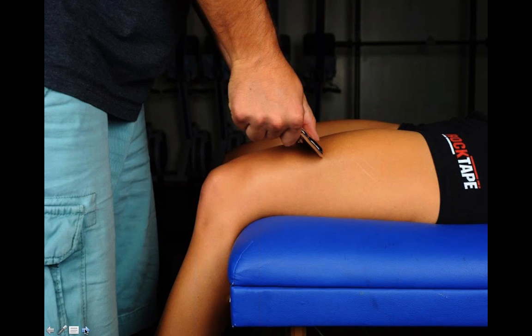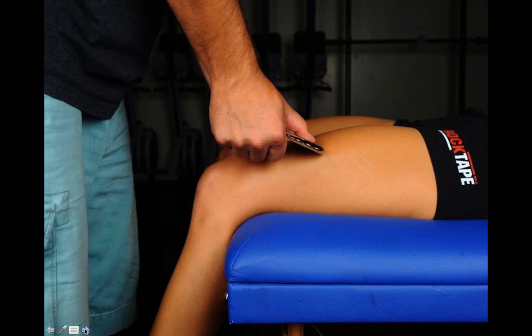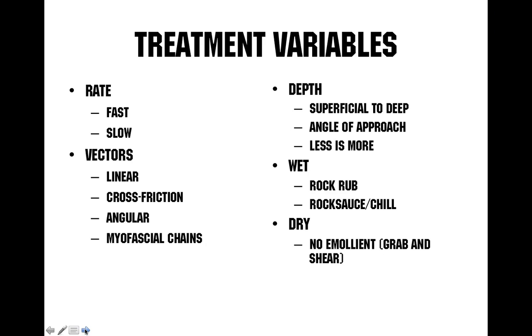This is the angle that we like to treat, if not 30 degrees, because 30 degrees is inducing some inflammation to your nervous system. And we could go fast right here. We can go very slow. We could go deeper. It all depends on what we're trying to do. And that's what we're trying to communicate, is what we're trying to do is really the main outcome. It's not about the tool. It's more about what we're trying to do to the patient.